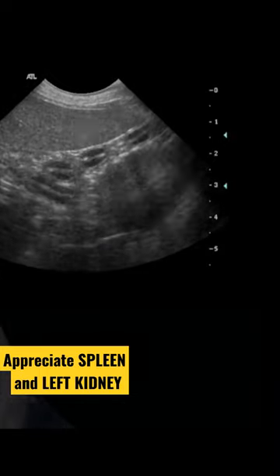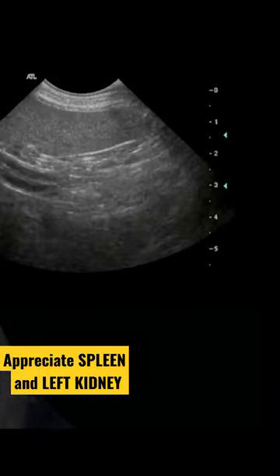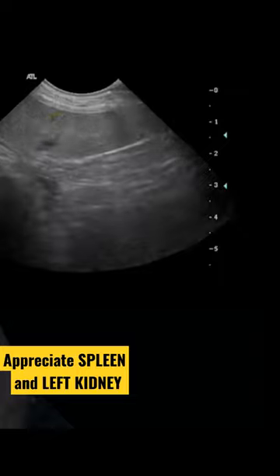The spleen parenchyma is normally uniform, except for the anechoic veins, whose walls are hyperechoic.